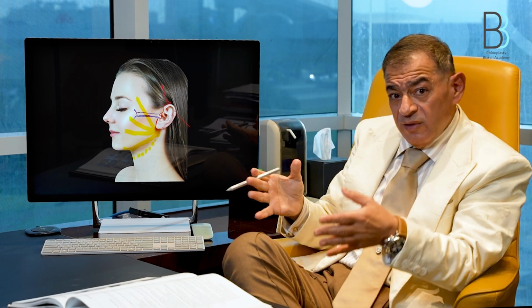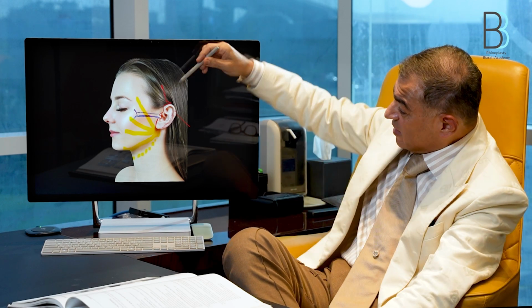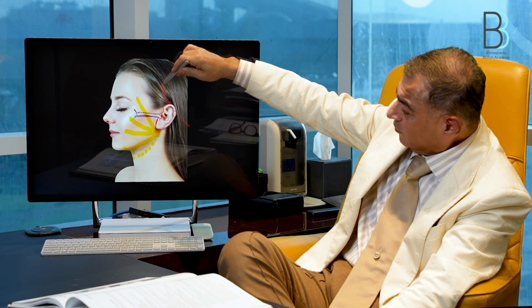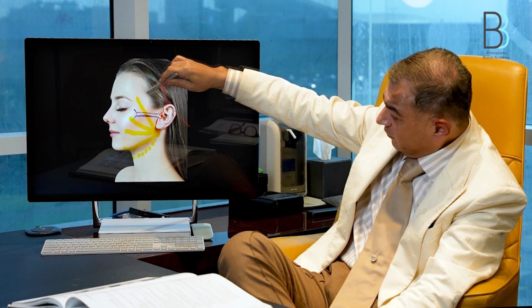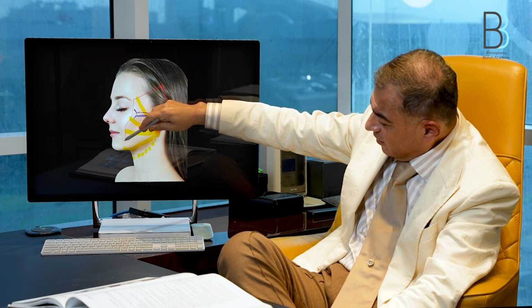Now, the next step is usually to do the skin undermining. Our skin undermining usually covers this area, like this.